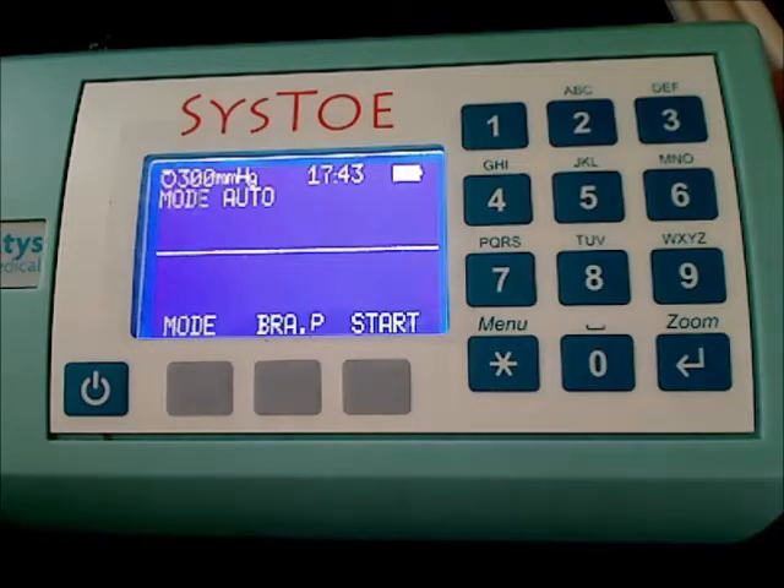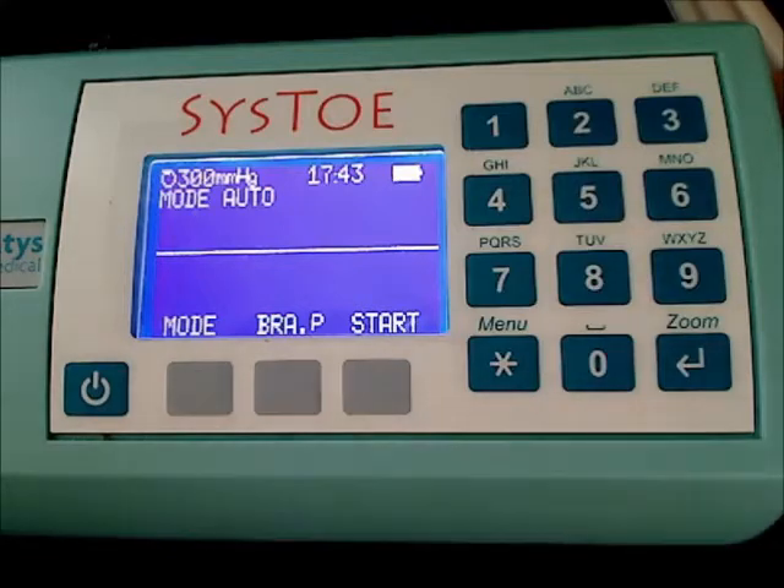It may happen that the battery is completely flat when you have a measurement to perform. In this case, connect the SysToe to the charger, perform the measurement, and then leave the SysToe connected to the charger for roughly 3 hours. The complete charge of the SysToe lasts roughly 3 hours.